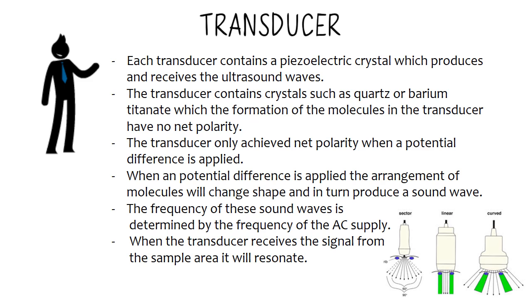The transducer, and you may have seen a transducer as in the images on the bottom right hand side of this slide. There is a sector, linear or curved transducer, and this is what the medical practitioner will apply gel to do the ultrasound scan. So each transducer contains a piezoelectric crystal which produces and receives the ultrasound waves.